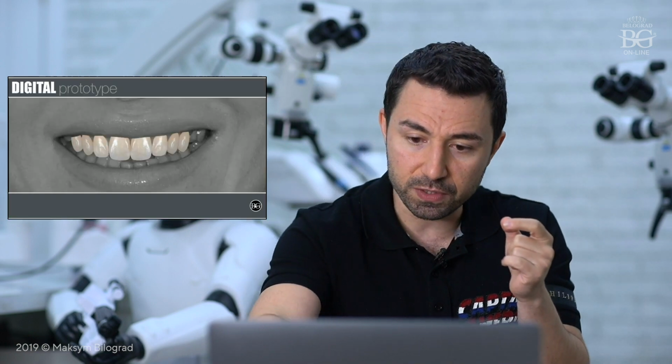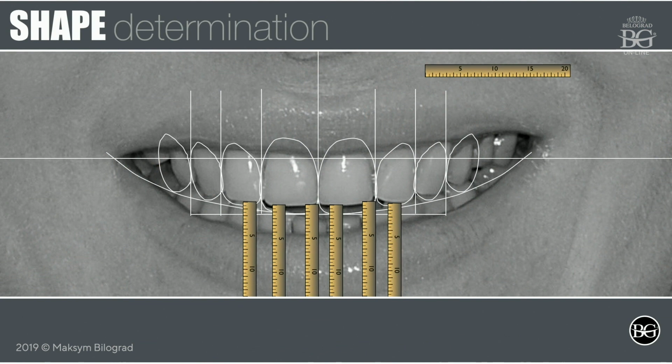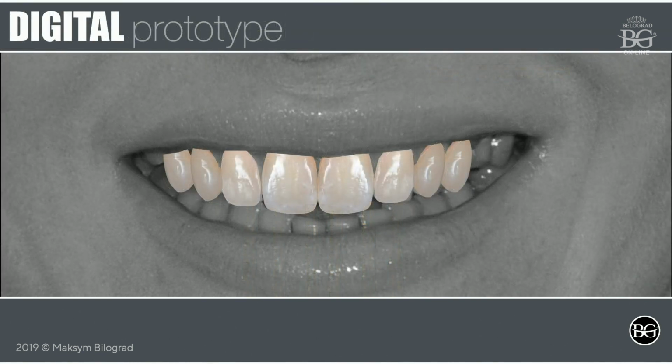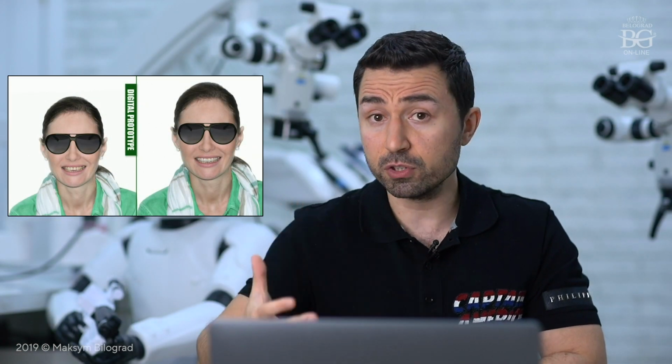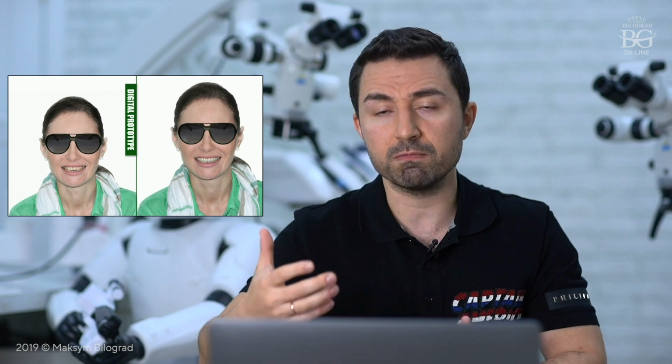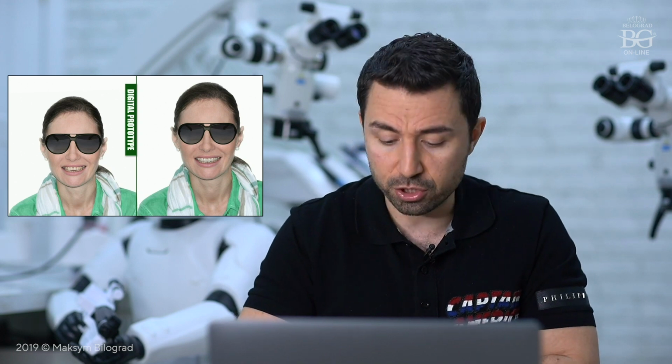But the contours and measurements, I mean geometry, length and width, will be taken as the base for the dental technician when he is doing the wax-up. This digital thing that you can see here and here is just the motivational part of the consultation, to show our patient initially how they will look with the changed smile.